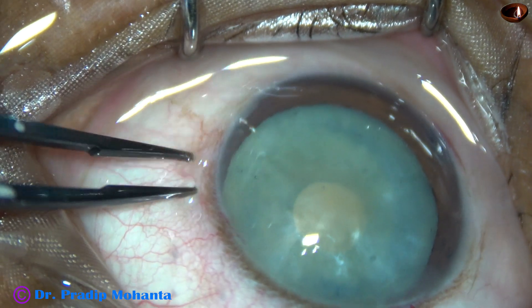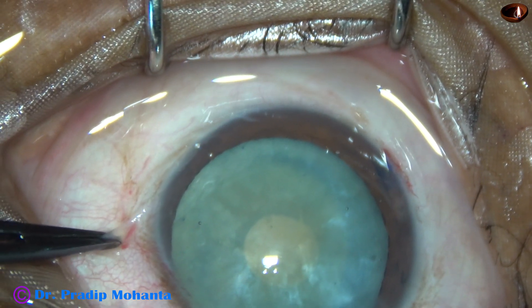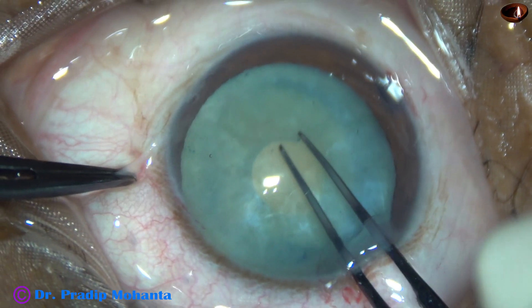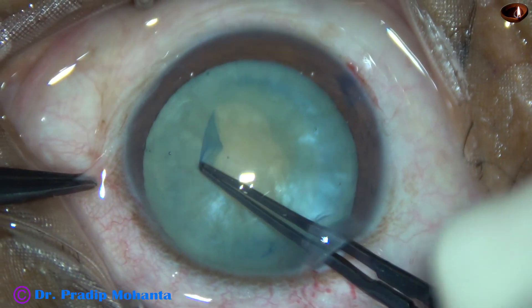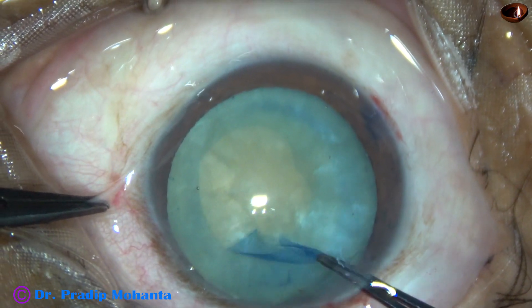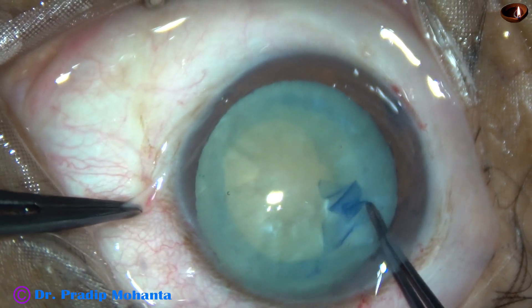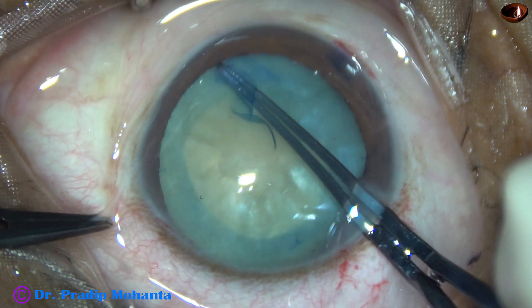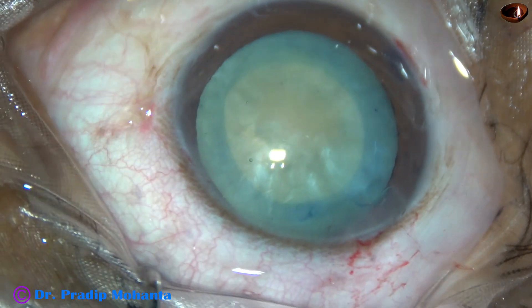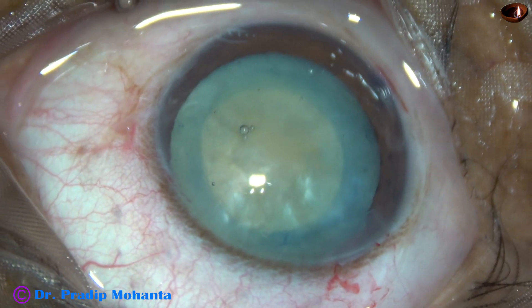VSCO is again injected — this is 2% HPMC — and a small cut is made at the margin of this small rexis. The small rexis is then enlarged to an optimum-sized rexis of about 5 mm. This cataract is soft; though this is a mature intumescent cataract, the nucleus is not hard in this first case. This is an adequate-sized rexis, and now some more VSCO is injected.